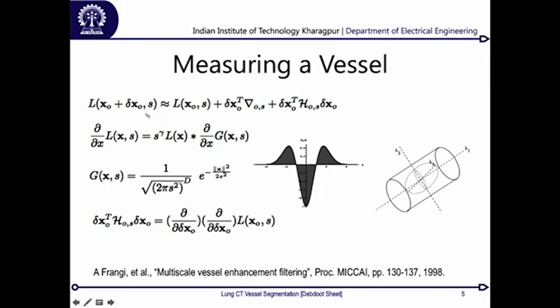Now where this scale comes from is, say you have a whole volume taken. Say I am taking a complete volume which is about 30 centimeters cross 30 centimeters cross 30 centimeters. Now in the digital space, say I am digitizing this into 512 cross 512 cross 512. This is one way in which my resolution would boil down to 30 centimeters divided by 512. This is my resolution along each dimension of space.